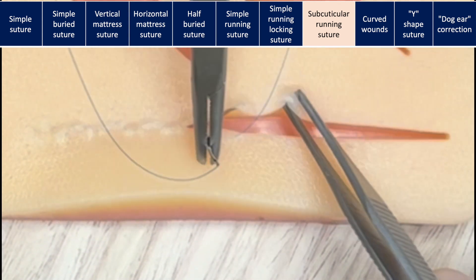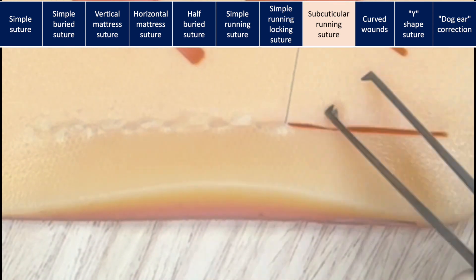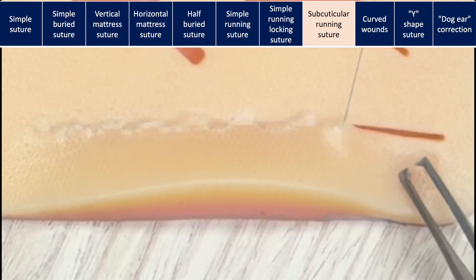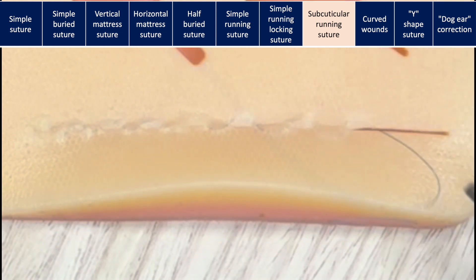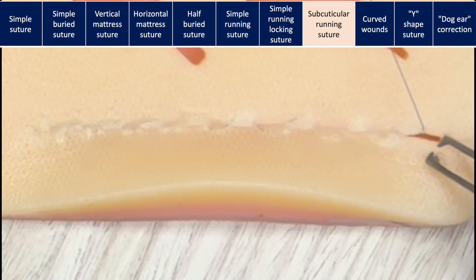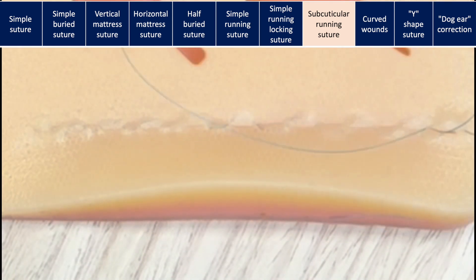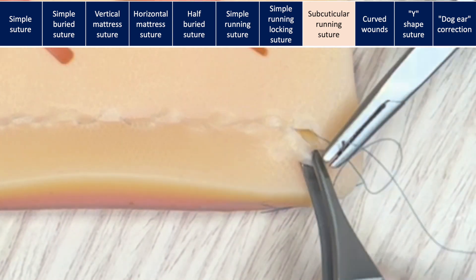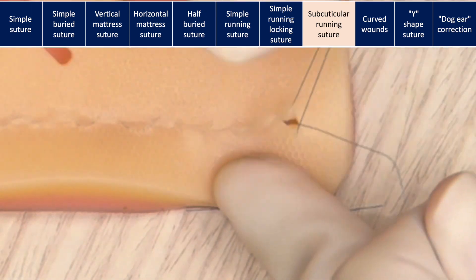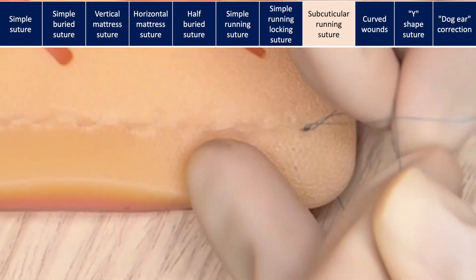In the subcuticular running suture, the skin is closed without leaving any suture material outside the wound. This is why this technique results in a more cosmetically pleasing closure. At the end, you will bury your knot again. To bury the knot, thread the strand through the loop and create a new loop. Tighten until the end and repeat this process three times. Finally, pass the strand completely through the loop and tighten. Then take the needle deep into the dermis and bring it out further away to bury the knot.